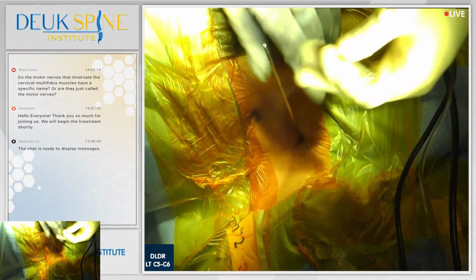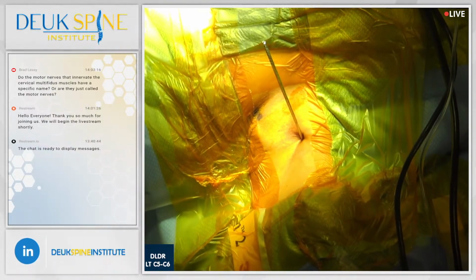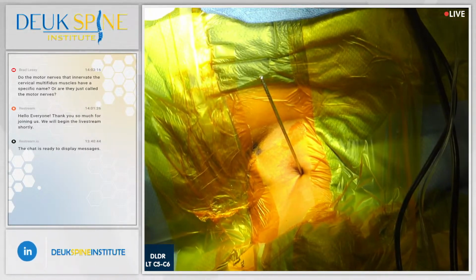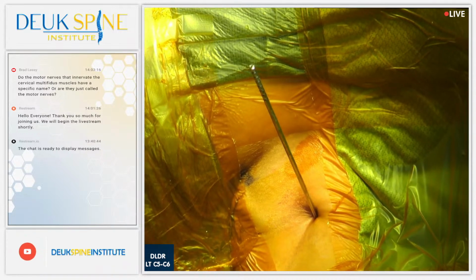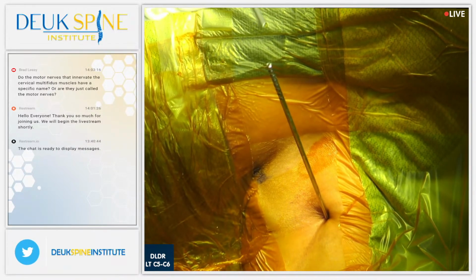All right, welcome back. You can see from the video that the Deuk laser disc repair, we go in, we find the tear that's ripped open in the back of the disc in the wall, and we clean the tear because it's full of scar tissue and calcium and herniation. We clean all that out with the laser so that it will heal.